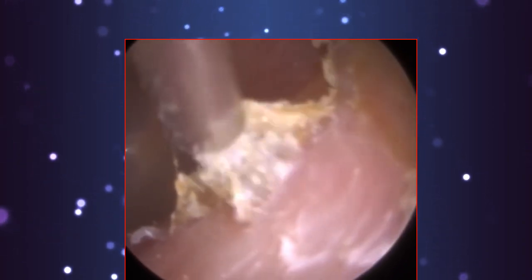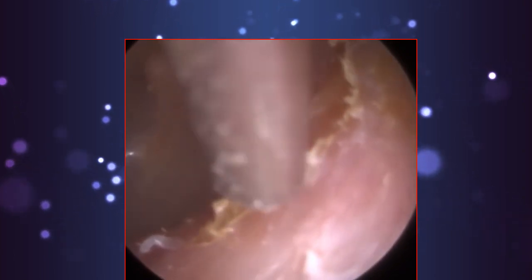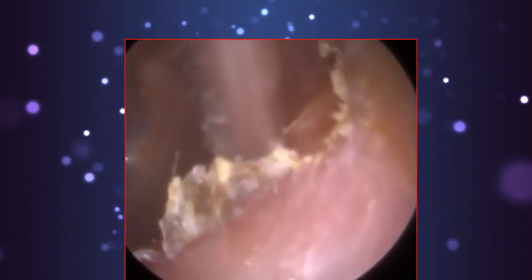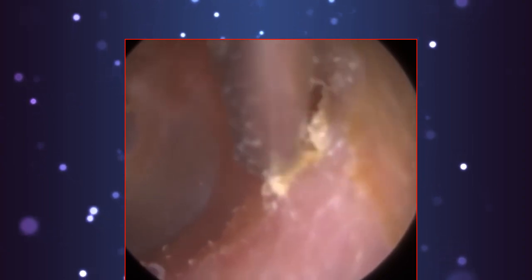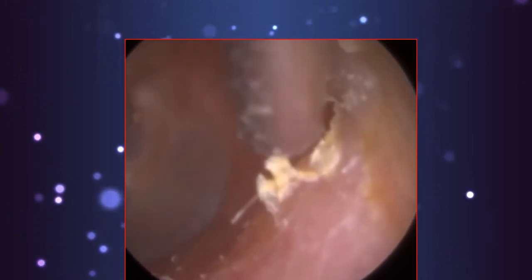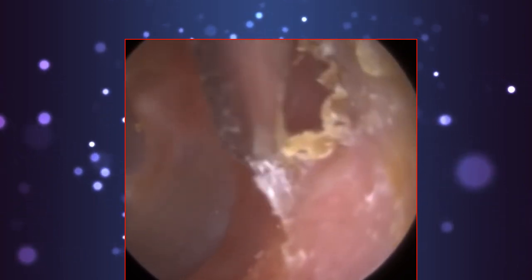So again, we're not going to be able to get every little aspect out. It's just not possible, guys. Just going to do as much as we can as safely as possible. And we're giving some patients some ear care tips. They are a keen swimmer as well, so we've recommended obviously really discussing water precautions. So some custom-made swim molds or over-the-counter ones as well, but custom ones are better. However, they're a bit more expensive, so they're going to try the ones at the counter and then revert back if need be.